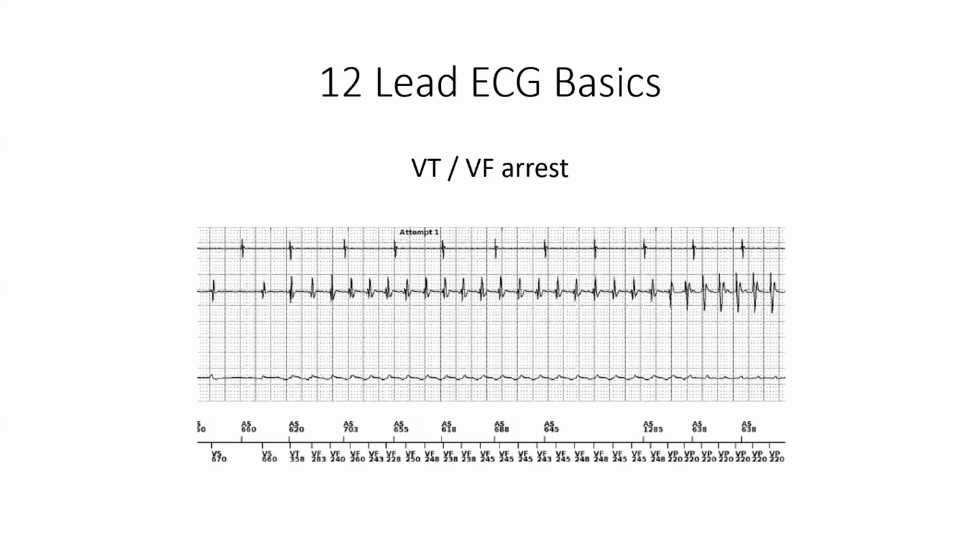And I had just seen him in clinic. We did a device check. We had a really nice visit, and everything looked great. He had not had any further arrhythmias. And the next day, literally the next day, he goes golfing and collapses in front of his buddies. This is the tracing, the EGM tracing from his defibrillator, which looks similar to a telemetry strip, but it's different.